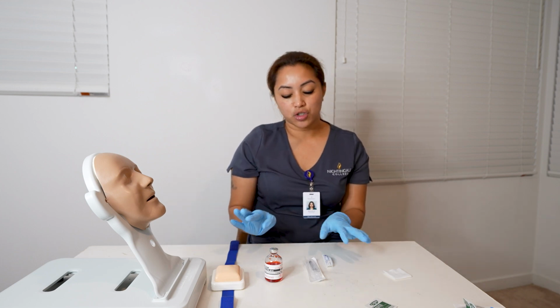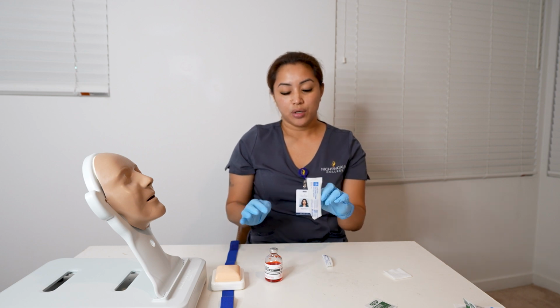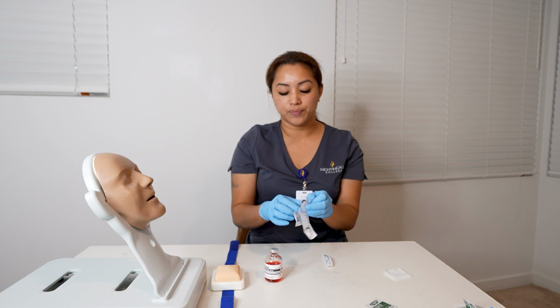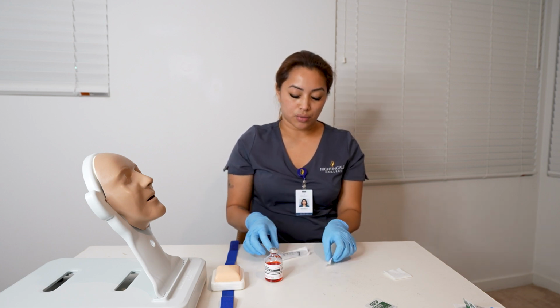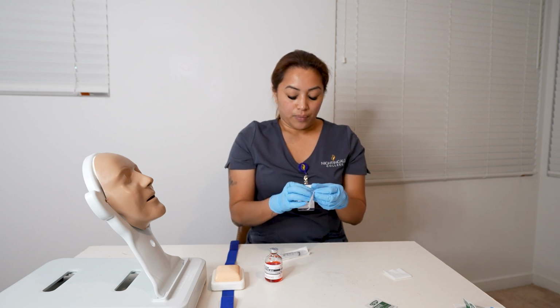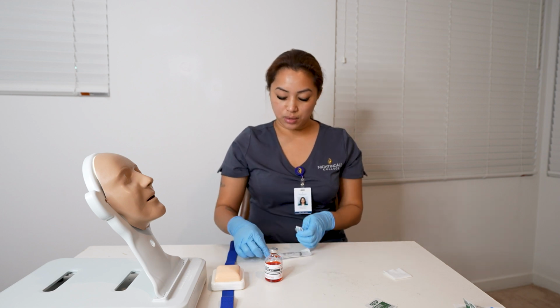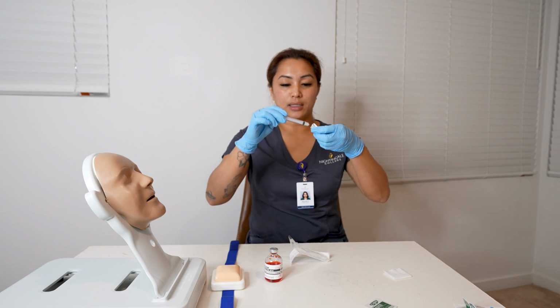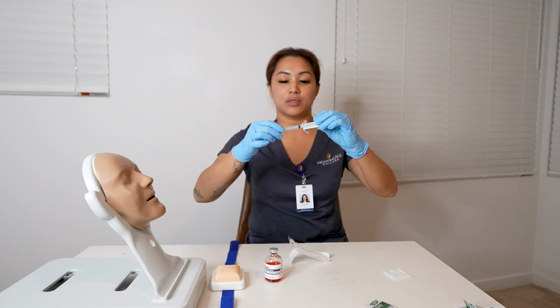Now I am going to prepare my syringe and needle. So now we are going to open this 3 milliliter syringe. It is open. So now we are going to open the needle. So it's open. So now we are going to get the syringe and connect it to the needle. So make sure that it is tight and it is not loose. The cap is still on.